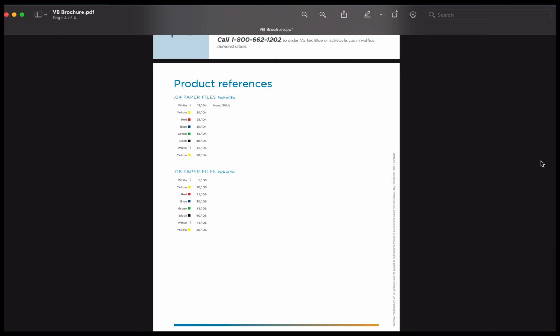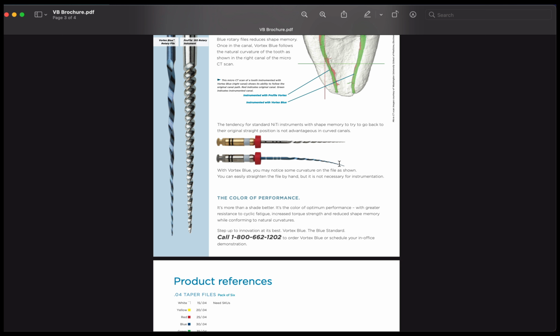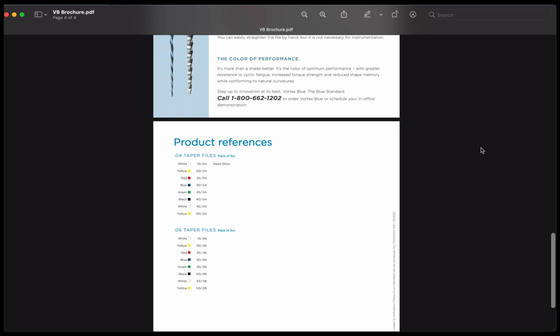And the advantages of being able to pre-bend a rotary file, you're going to learn this pretty quick, especially if you're doing molar endo, that in some canals, really a lot of times I find the MB canal, the mesial-buccal canal of lower molars, it's challenging to get the correct angle to introduce the file into the canal sometimes. But when you put a little pre-bend on the rotary file, you can much more easily get that file into place in the area of that canal orifice. So the ability to pre-bend files seems like not a big deal, but for those who do a lot of endo, it's actually a massive upgrade when they started to heat treat these files.